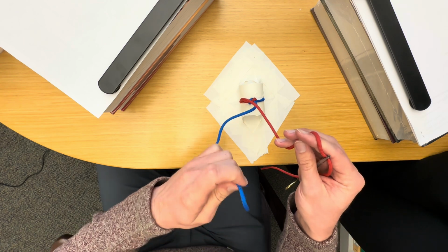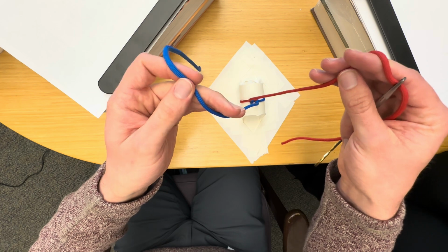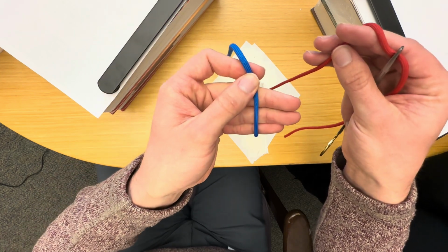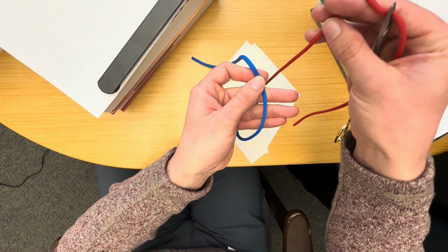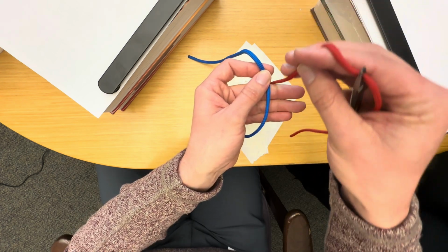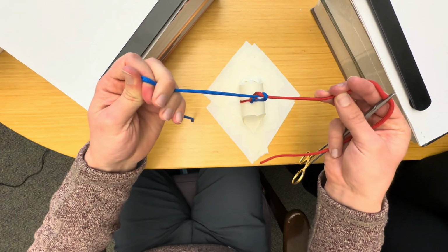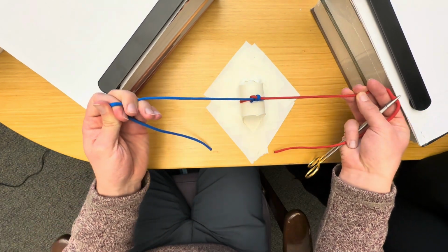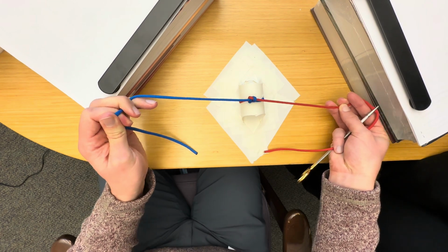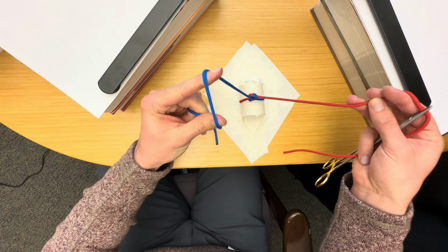The thing that I like about this is if you grab it like this, then you don't have to readjust the tail in your hand. So you just have your tail hanging over your three fingers. You bring the needle with the needle driver string over your middle finger. Middle finger comes through, grabs it. Once again, it's important to put the same amount of tension on each side so that your knot lays down flat like that. So we just did the karate chop, so we're back to the C.